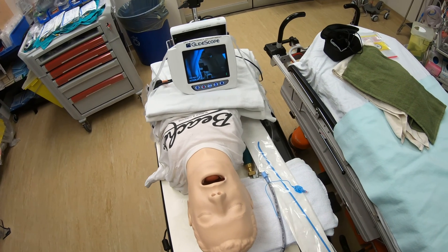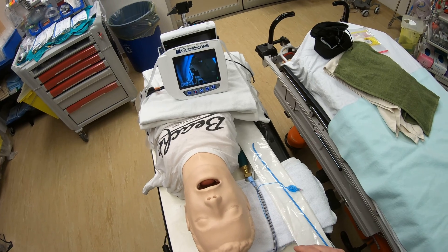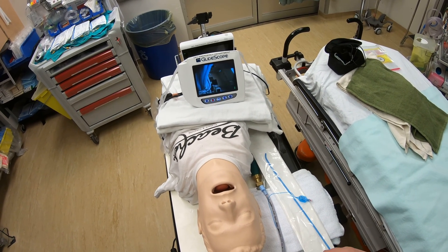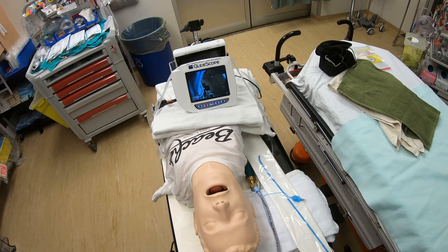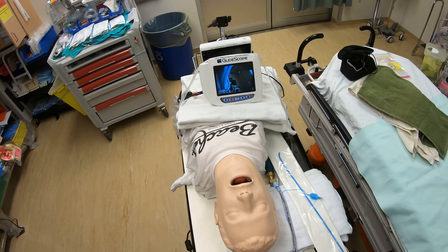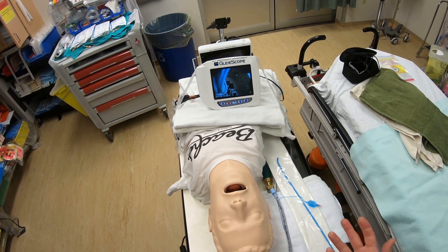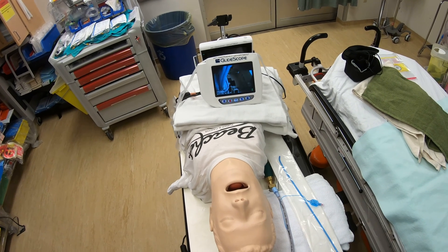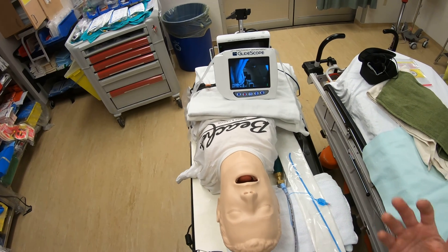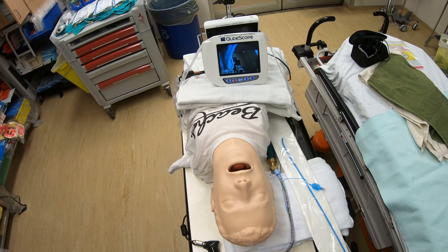This is my approach to hyperangulated video laryngoscopy. First, a quick note about positioning. There is some controversy — and I think poor evidence — suggesting that neutral is better than sniffing. Anatomically, I think sniffing position makes sense, though it remains unsettled. I will leave the patient in whatever position they are in, but I'll be biased towards sniffing. Do what you feel is most appropriate.